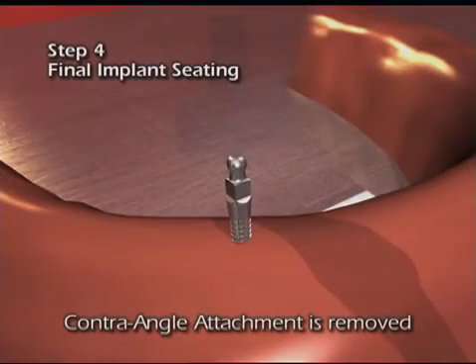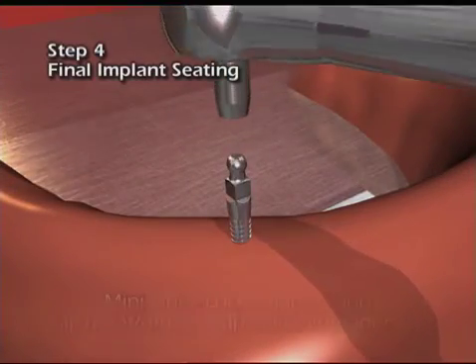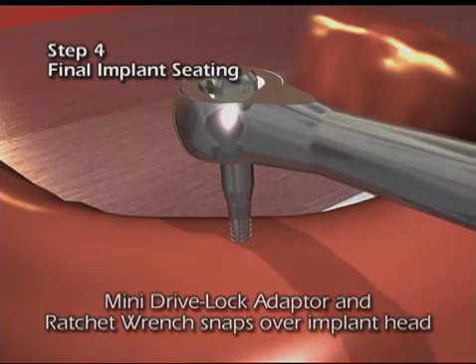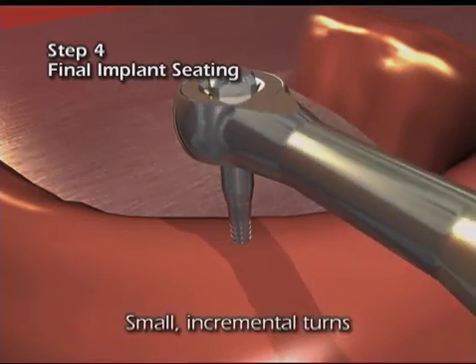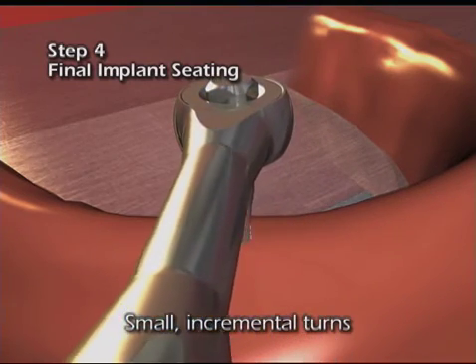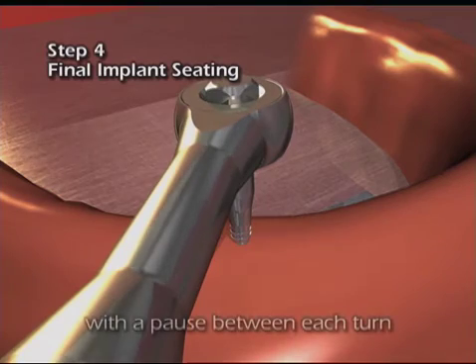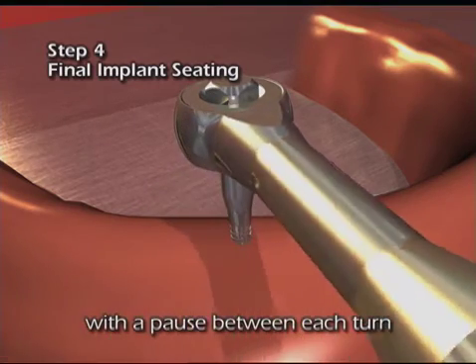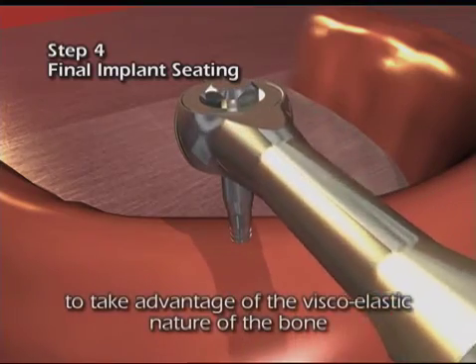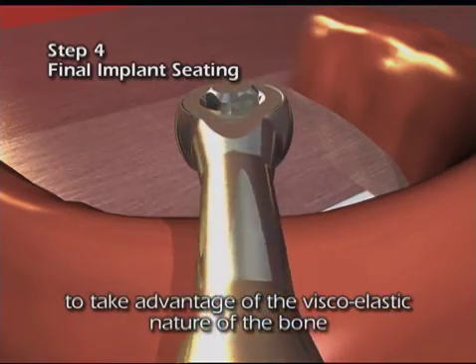The contra angle attachment is removed. The mini drive lock adapter and ratchet wrench snaps over the implant head. Small incremental turns with a pause between each turn to take advantage of the viscoelastic nature of the bone.